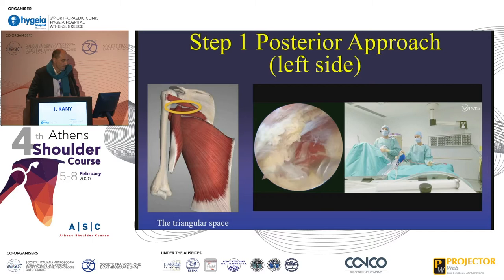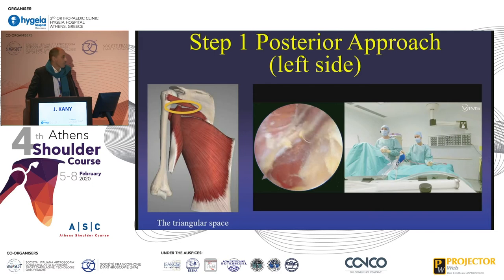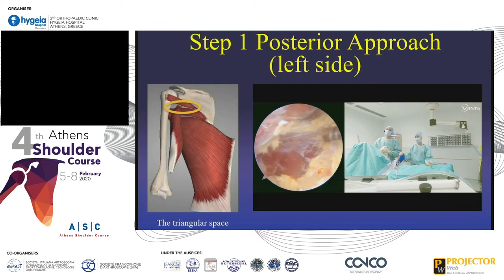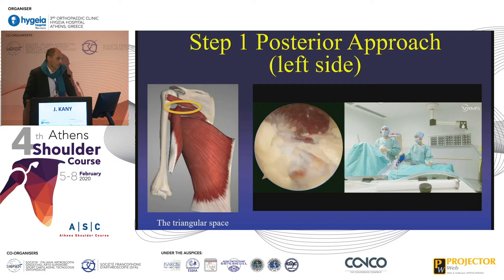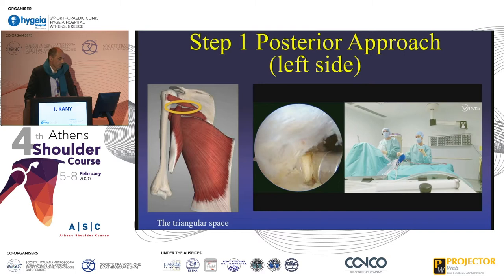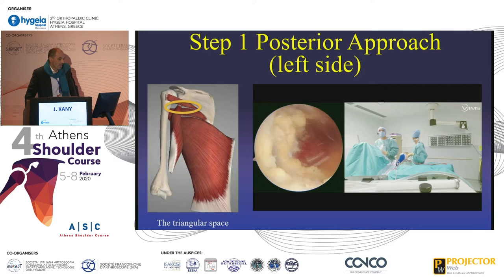Take care, because if you see some vessels or some nerve, that means you are too lateral — you are into the quadrilateral space, and this is a very bad idea. You can see the muscle; it seems very big. So you continue the dissection — the more you do, the less dangerous it is. Then you go a little lateral and you open, and you can see something which is vertical. What is vertical on the left of your screen is the long head of the triceps. You continue the dissection, but stay medial from the long head of the triceps, because this is the safe area.